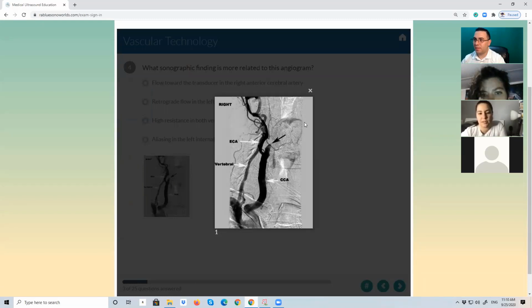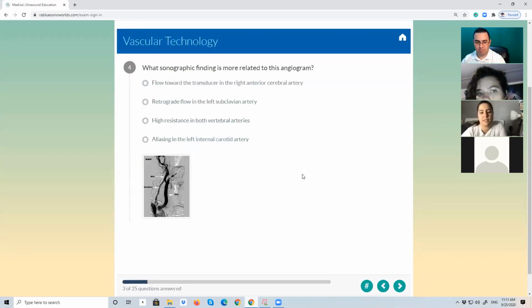So now try to think about the circulation, how would the patient still be able to get flow? Something that would be different from what you usually get. You would have a different kind of flow in a vessel. Instead of, let's say in the portal vein, when something is wrong, it changes direction. Something is changing direction here. What vessel do you think it would be?